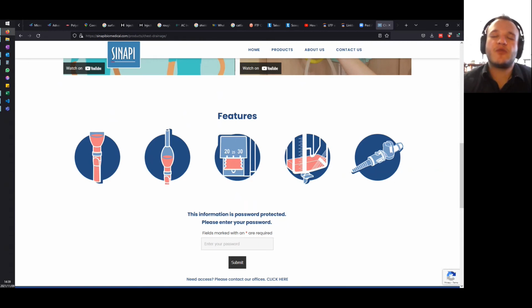The software that was used was actually very powerful software. You could tell it exactly what it is you needed, and it was able to run those simulations. It would accommodate for the ambient light, the wavelengths of the light you're using. It even accommodates for the various materials that were being used, as this allowed us to also see what materials would actually be useful in the device and what materials would not.